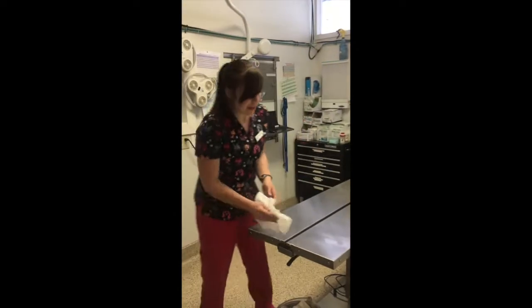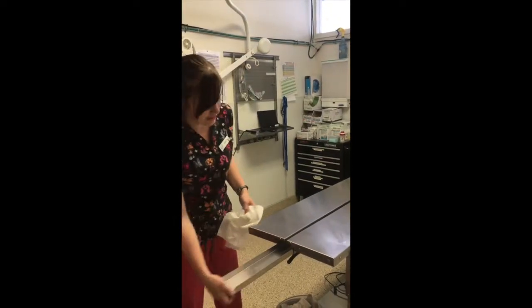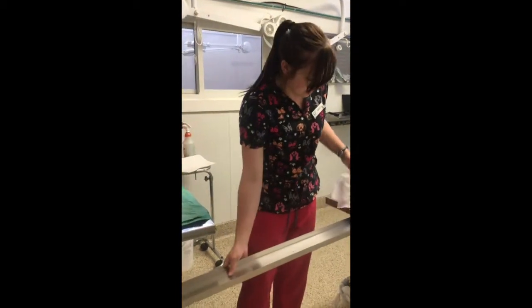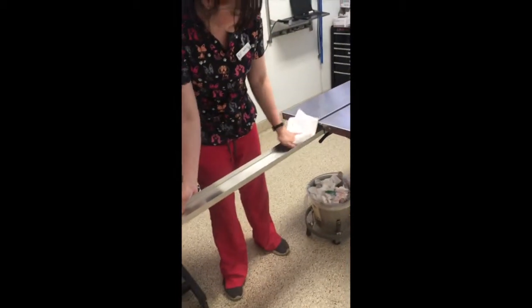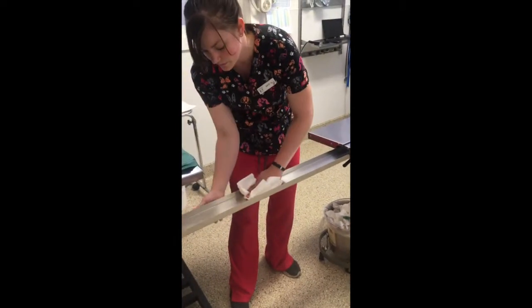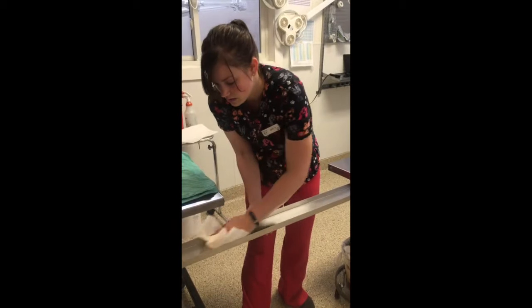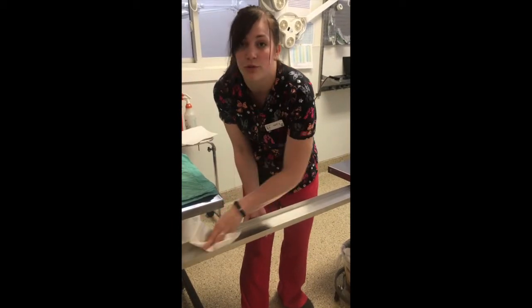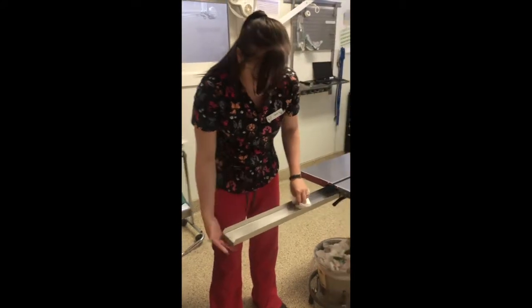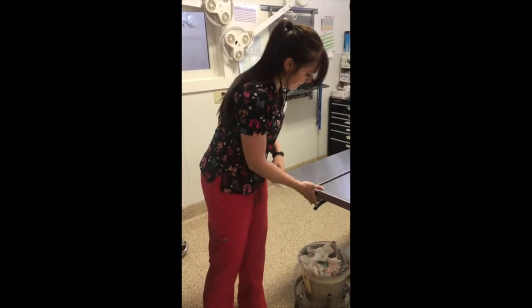Alright, once that is done, we want to go ahead and take the tray that's in it and put it around. So you can see any debris and material that got inside the tray. You just want to wipe that up. This is where any extra fluid or blood from the surgeries would end up. So I'm going to make sure that all is out.